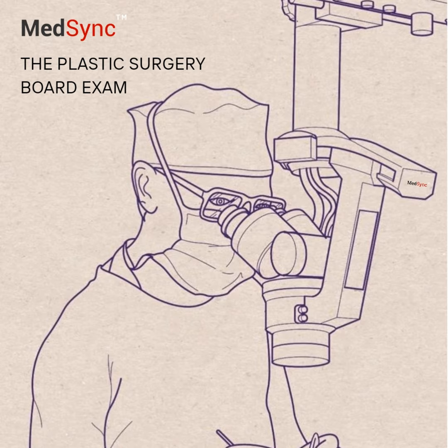You mentioned tooth buds. Yes, tooth bud injury is a serious concern in pediatric cases. And then there's placing the device incorrectly, leading to an inappropriate vector, distracting in the wrong direction. That can create a worse deformity. And if distraction fails completely? In some cases of non-union or significant problems, you might need to abandon the distraction plan and resort to conventional surgery with bone grafting.